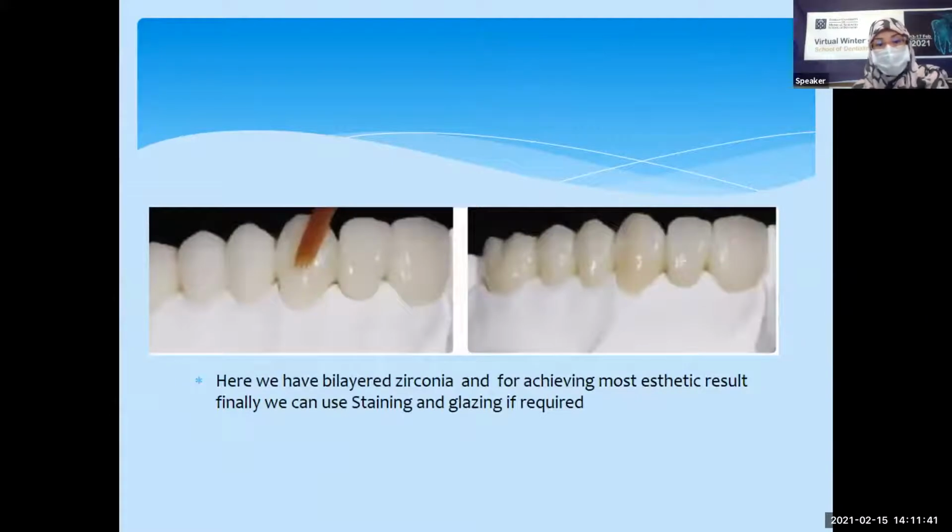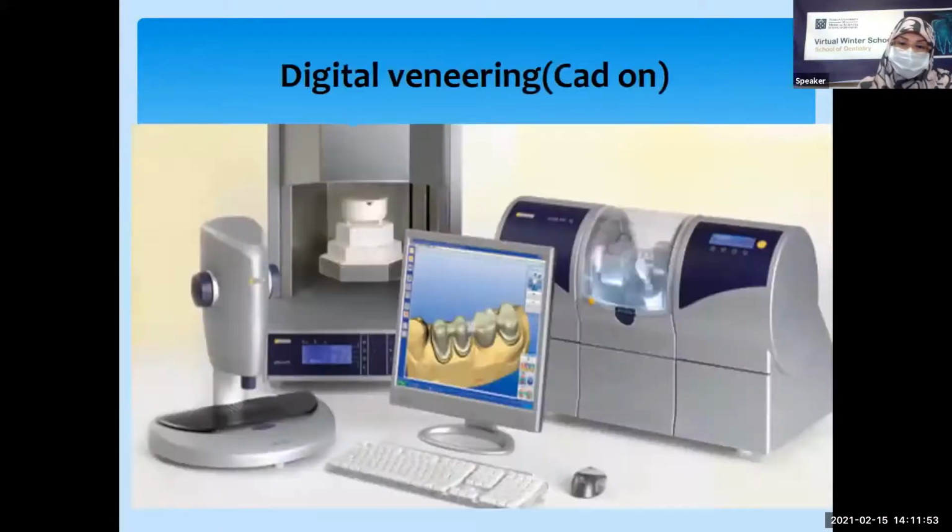Finally, we have bilayer zirconia, and for achieving more aesthetic results, maybe we could use staining and glazing if required. And the CAD/CAM veneering technique. Let me give a quick explanation about the CAD/CAM technique.